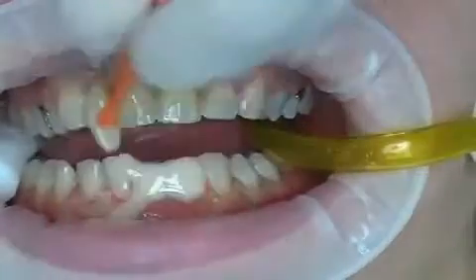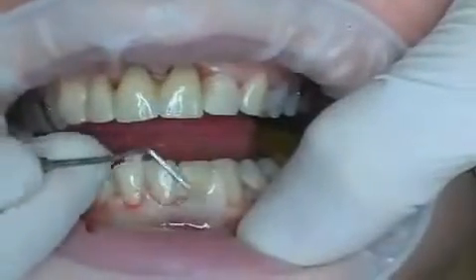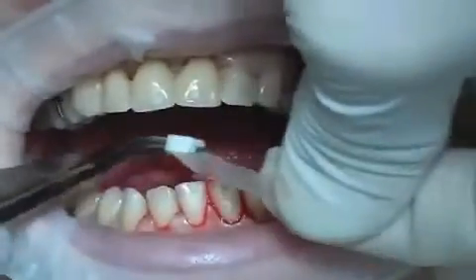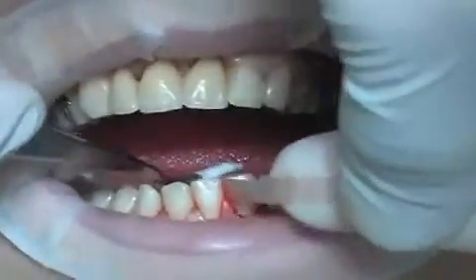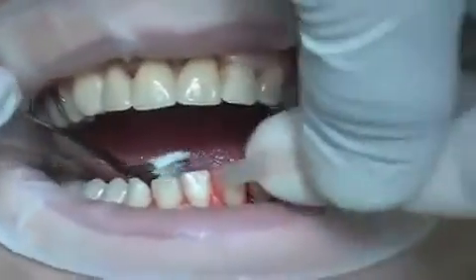Finally, the veneers are inserted. Surplus material has to be carefully removed, otherwise it will cause gum inflammation. Furthermore, thorough polishing is necessary because rough surfaces enable fast plaque settlement that may result in cavities. The gums become irritated for a short time, but they heal quickly.